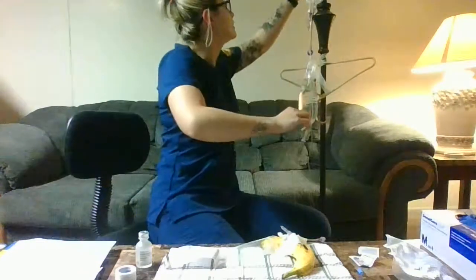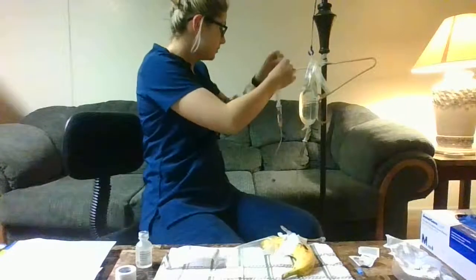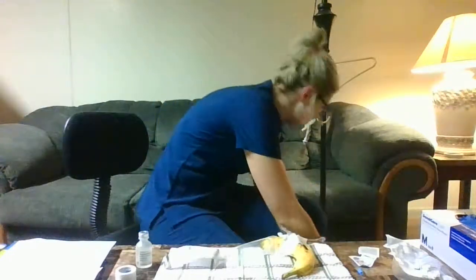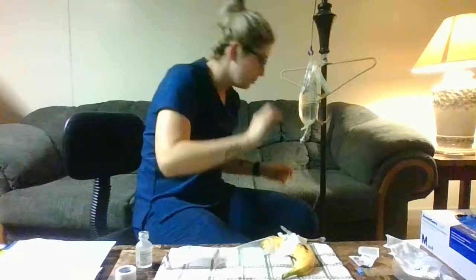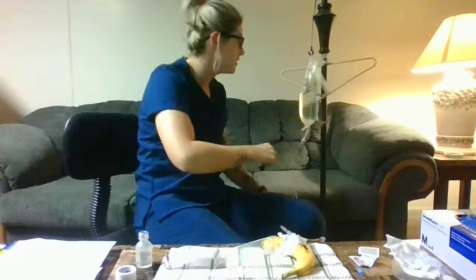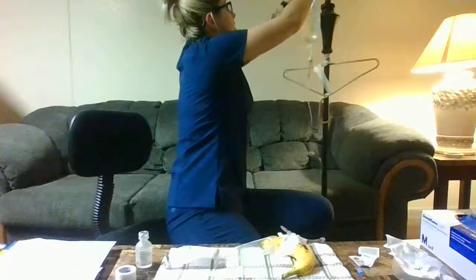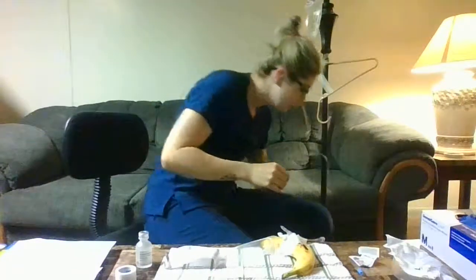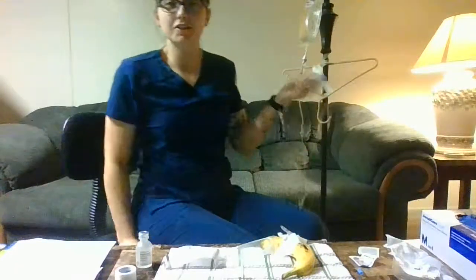You are going to remove this here. You can put your gloves on, take this apart, clean that. You're going to put your main IV bag back up to the top, and then you're going to use the clamp and establish the rate that was already ordered before by the doctor.